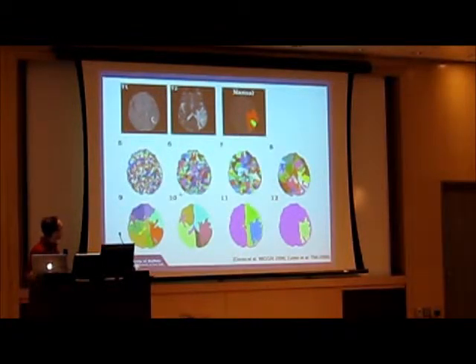You can notice as you walk up the hierarchy, the multiple layers in the hierarchy, that, for example, the enhancement on the side of the tumor is actually popping out pretty easily in here. And then you have the necrotic regions here. Finally, you also get the whole edema here, and so on. So some nice results. But this is just a feed-forward bottom-up algorithm. No classes, no learning, no data, nothing like that.